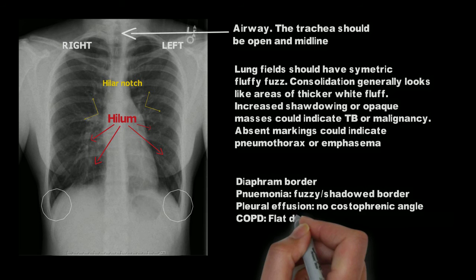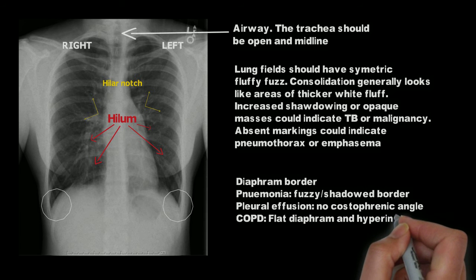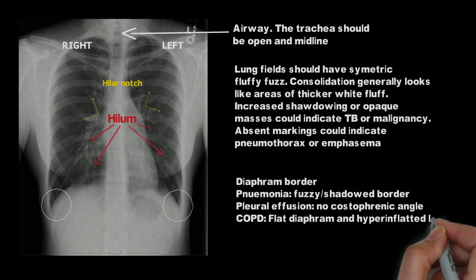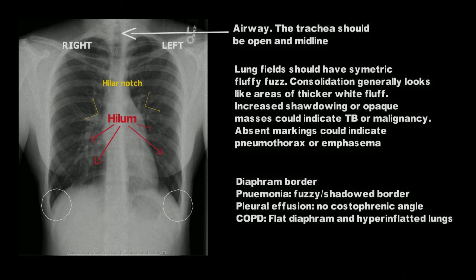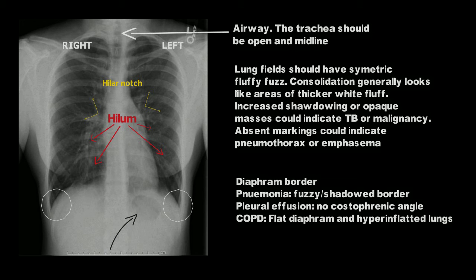A diaphragm that doesn't have this nice curved appearance and is instead more flattened is common with COPD. Incidentally, below the diaphragm here, you can see this bubble. This is a gastric air bubble, a very common and normal finding.